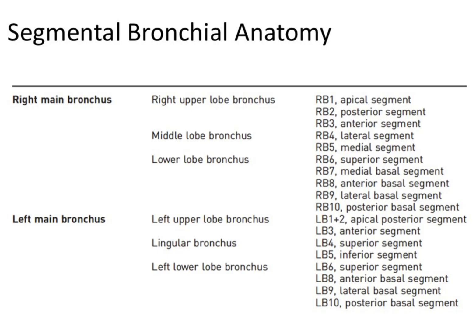We have the middle lobe with the RB4, the lateral segment, and the RB5, the medial segment. And we have the lower lobe bronchus with the RB6, the superior segment, the RB7, the medial basal segment, the RB8, the anterior basal segment, the RB9, the lateral basal segment, and the RB10, the posterior basal segment.